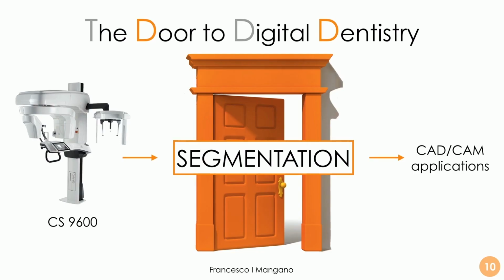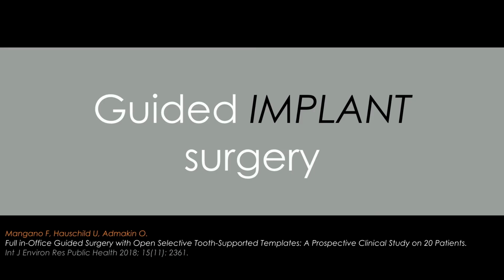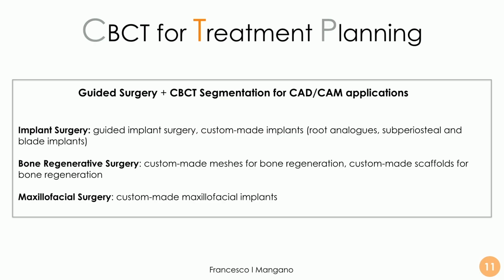So cone-beam computed tomography can be considered a powerful tool for diagnosis, but also a very powerful tool for segmentation through the DICOM file, opening opportunities in computer-assisted design, computer-assisted manufacturing software for clinical application. And this is how it works with the treatment planning. For example, we can use DICOM file for guided surgery, we can use DICOM file for segmentation, for computer-assisted design, computer-assisted manufacturing application. Just a few examples.